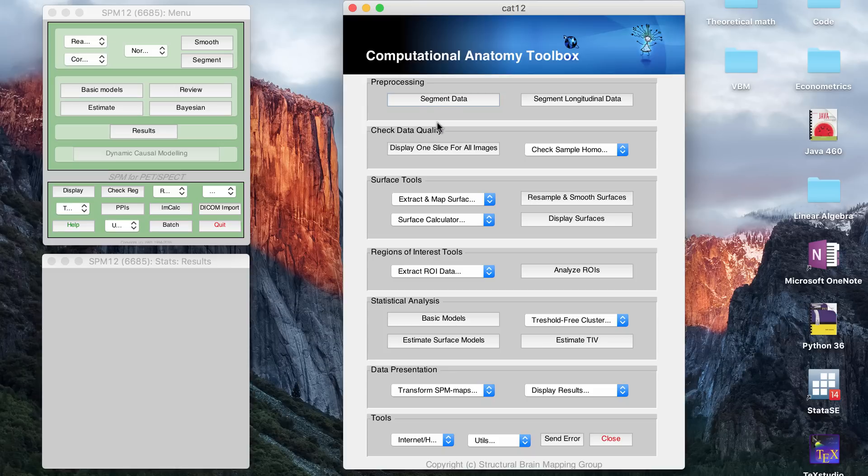After your data is smooth, then you're going to be able to create a statistical model. And so you use the CAT12 basic model button.